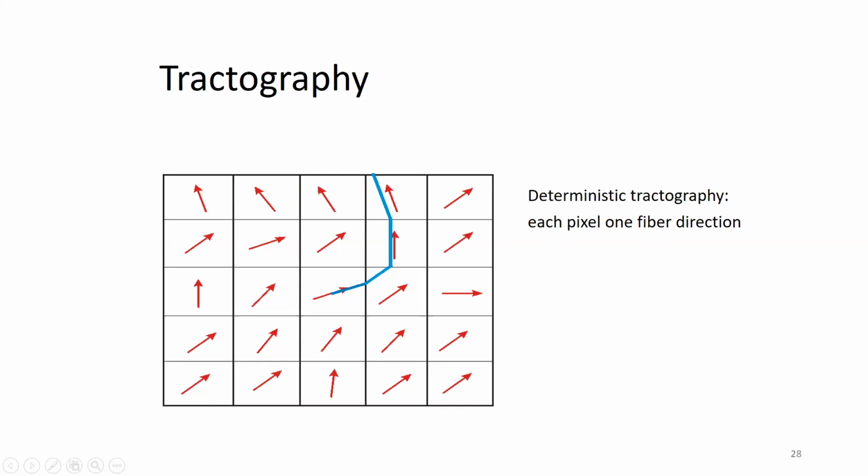But again, what was approximately the spatial resolution of my diffusion-weighted images? How big were the voxels? Two by two by two approximately, yeah. How big is an axon with myelin around it? Or how many axons with myelin will fit into a 2 by 2 by 2 voxel? Hundreds, thousands, a lot. I don't know exactly how many, but not just 2 or 3, but really hundreds.